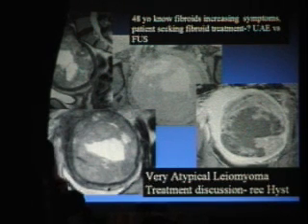There are no typical features on imaging for leiomyosarcoma. There has been one paper recently written about MRI saying that if we have a high percentage of T2 signal, greater than 50% high signal on T2, and equally a greater percentage of high T1 signal, and that enhances after the injection of gadolinium, these three features indicate non-benign fibroids. It's only one paper. There's not enough data to say those signs are 100% reliable. And as you know, leiomyosarcoma degeneration is extremely rare, less than 1% of all fibroids.